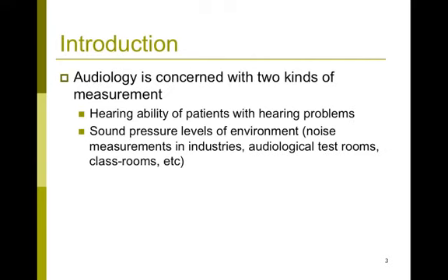Audiology in general is concerned with two kinds of measurement. For the most part, as a clinical audiologist, you're involved with assessing the hearing ability of patients. But you might also be involved in measuring sounds in general.